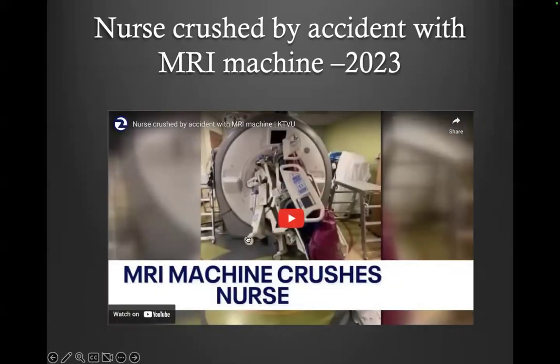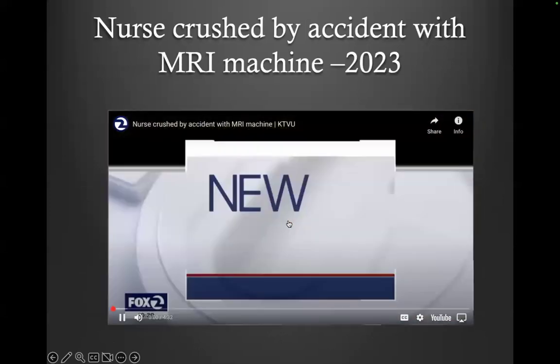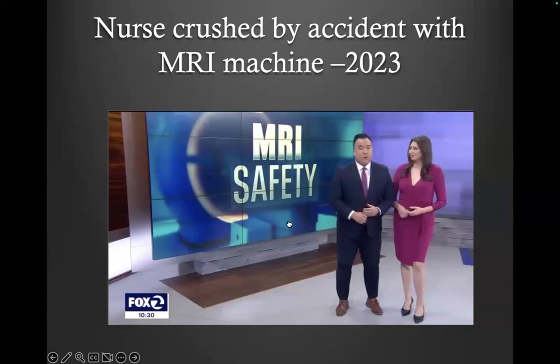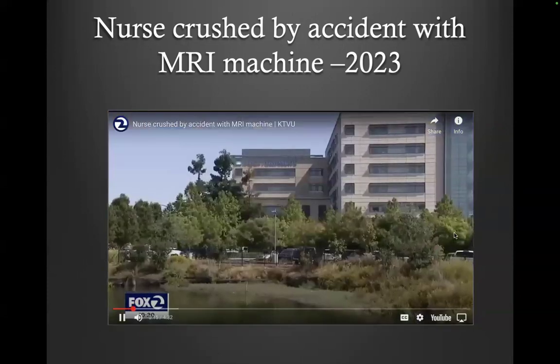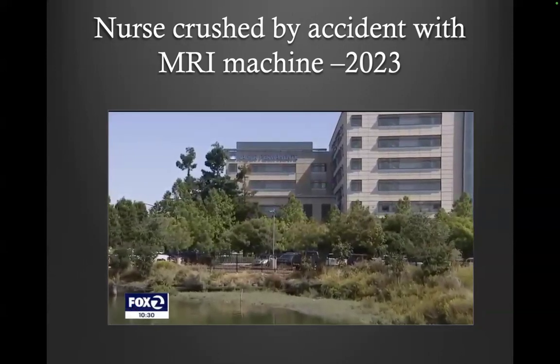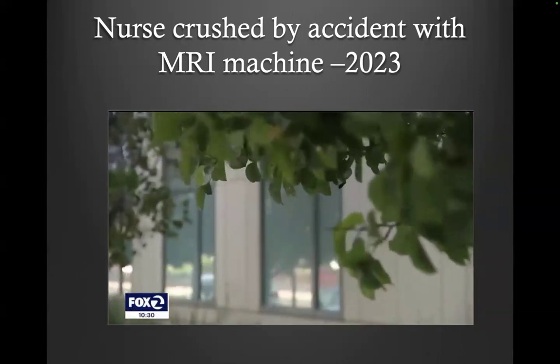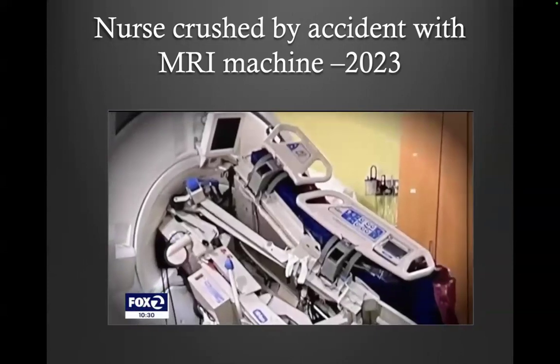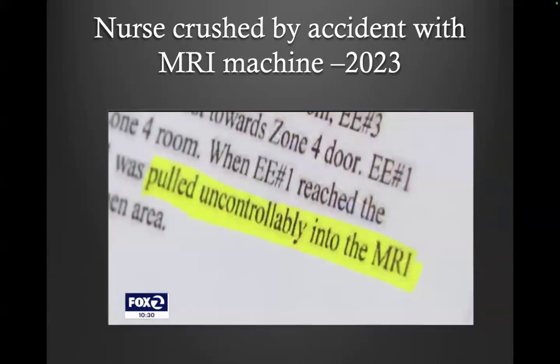And there's another accident. New at 10, a freak accident at a Bay Area hospital, an MRI scan that went horribly wrong. Now there are claims that lack of oversight is putting patients at risk. It was late February at Kaiser's Redwood City Medical Center, an ordinary day from the outside, but inside an MRI technician reported hearing screaming coming from the other room. This photo explains why. The hospital bed was pulled uncontrollably into the MRI machine by its magnetic force.